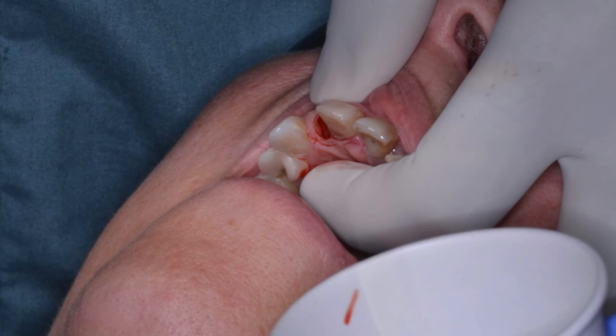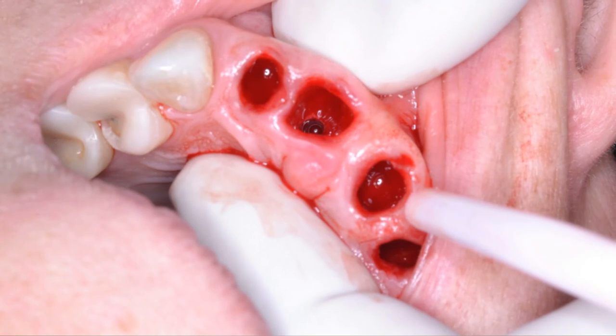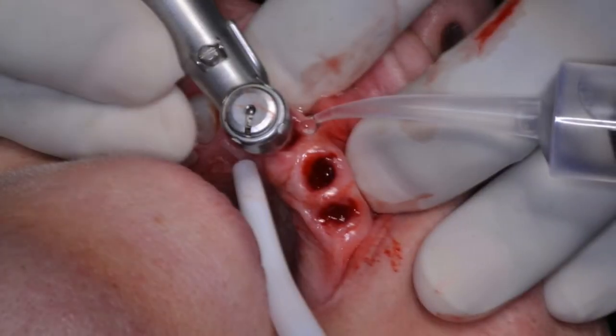And you can see that we've taken all the maxillary incisors out now. You can see in that one picture there, the right first maxillary central incisor on the right side. You can see the little osteotomy that we made in that dense palatal bone to retain an implant in the dense bone. And you can see here, we're continuing our osteotomies with our progressive set of twist drills. And in this photograph here, you can see we're placing that first implant.